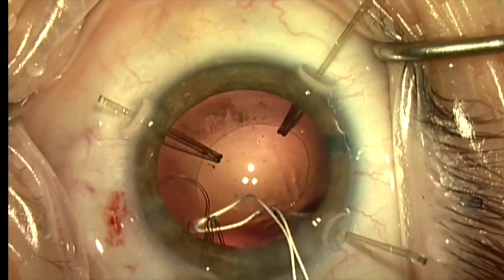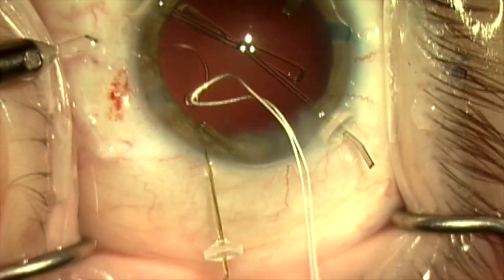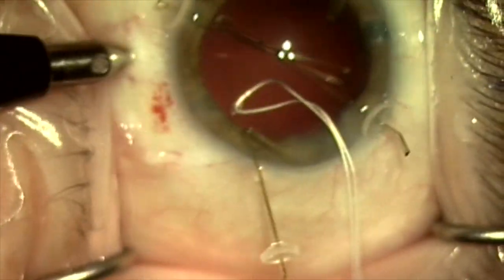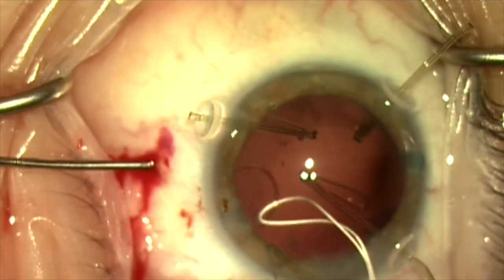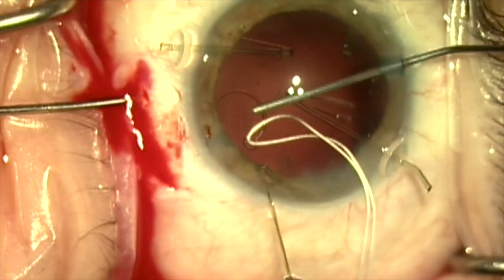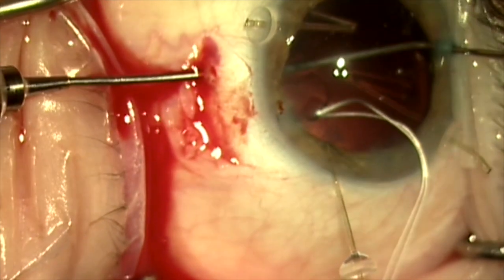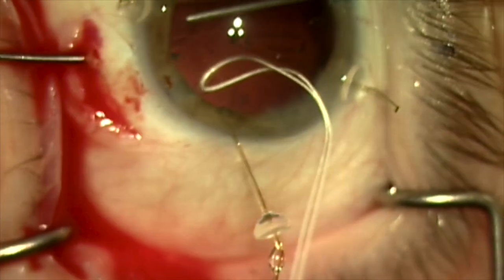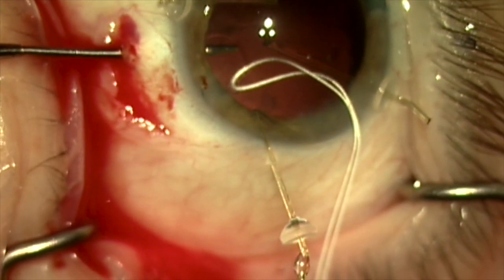We'll now make a small peritomy at 6 o'clock, and I'm going to make a sclerotomy about 2 mm posterior to the limbus, trying to come right in between the back of the iris and the anterior capsule. In this patient the space is very narrow, and there's a little bleeding as I enter. I'm using my right hand to inject dispersive viscoelastic to provide some space while maintaining internal pressure that will keep the blood from entering the eye.